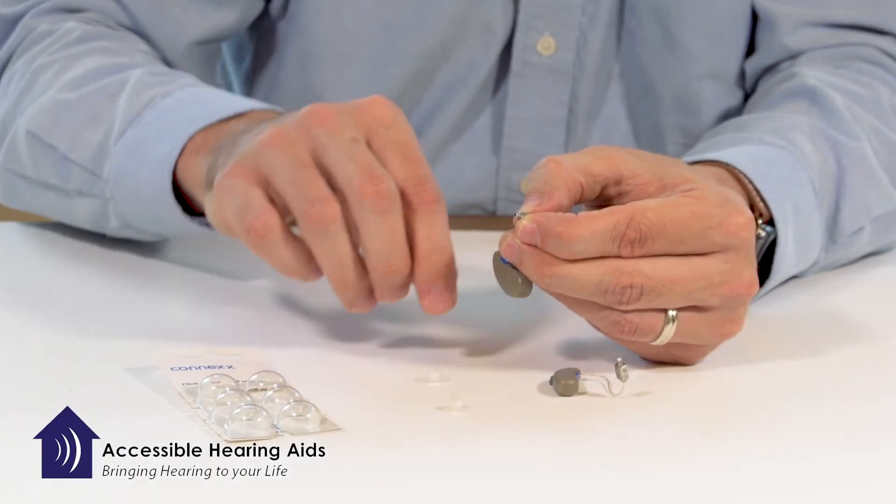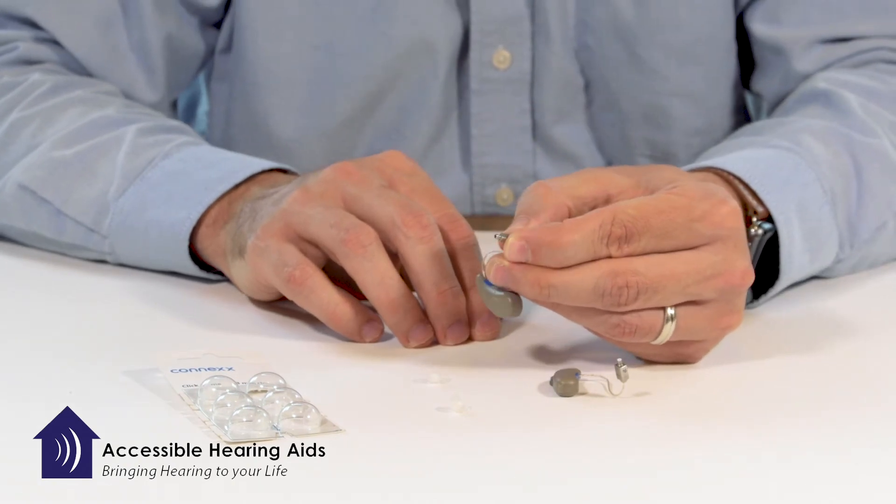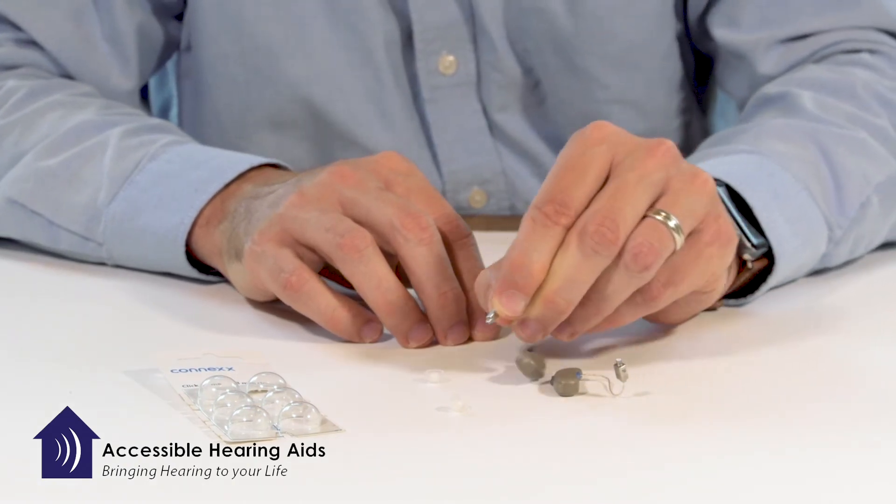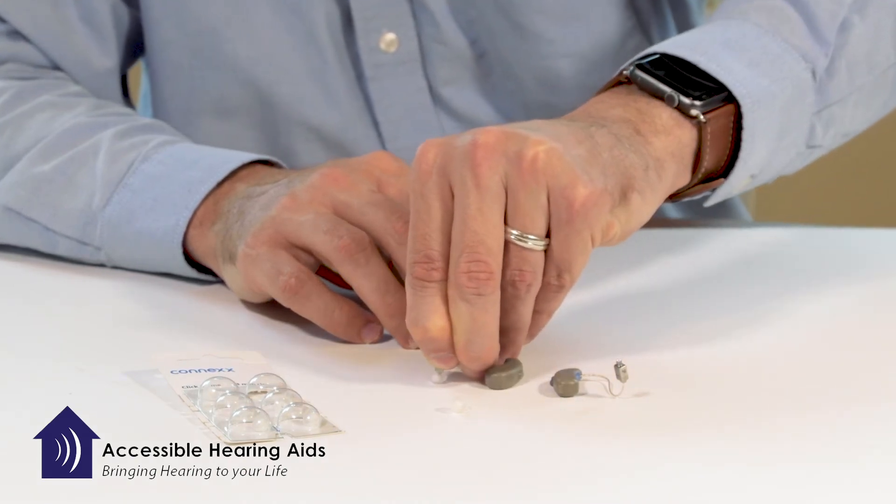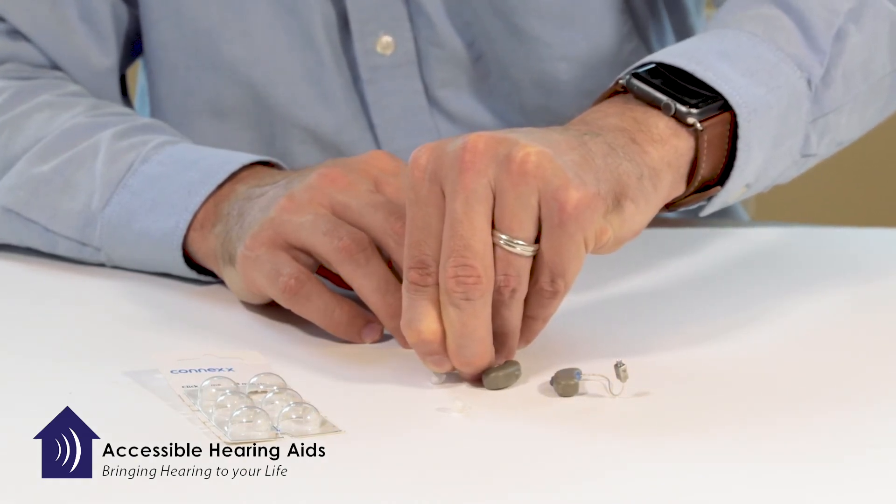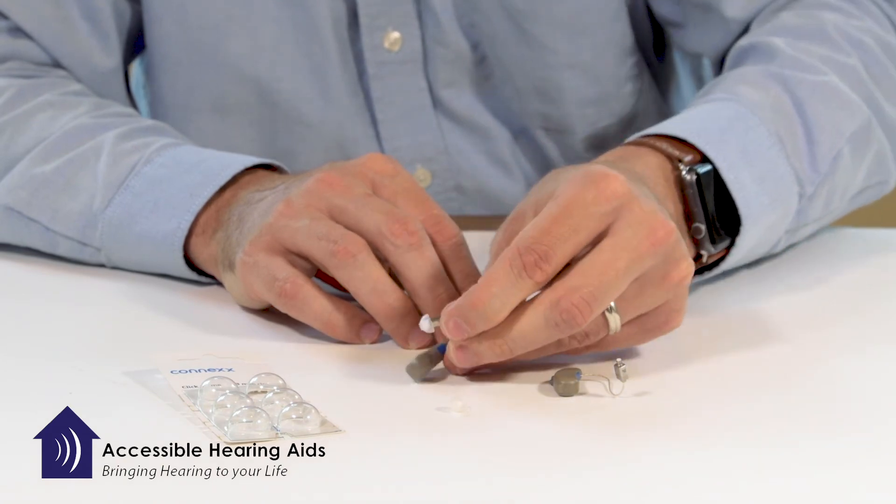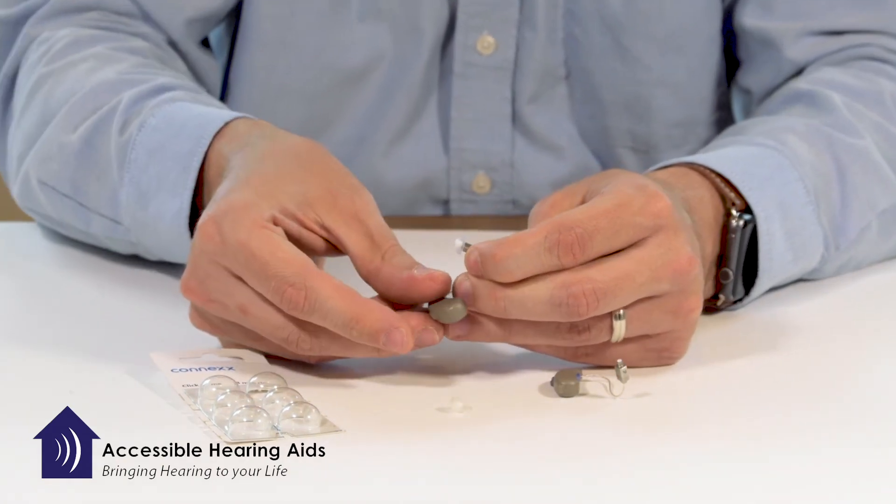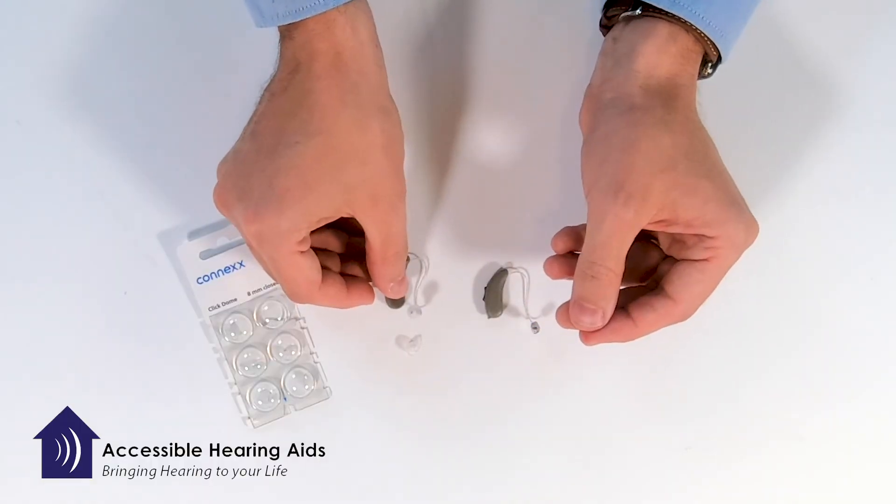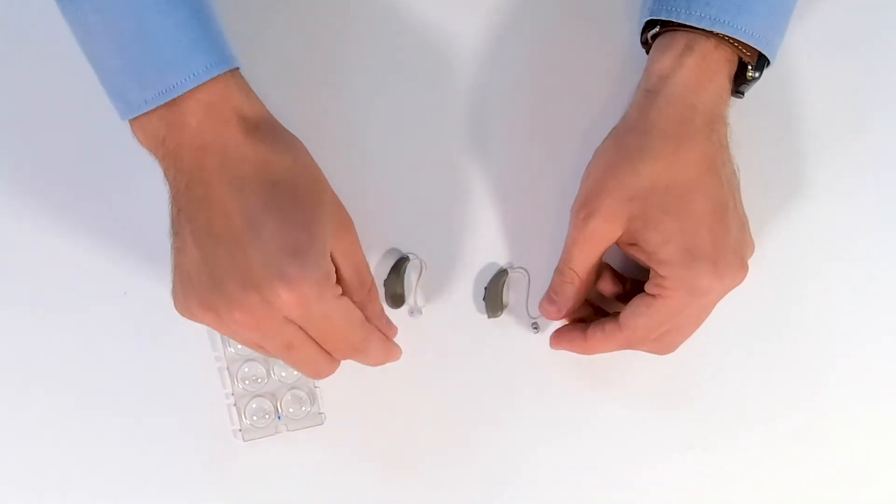You can also lay the tip down on the table and just gently line up the receiver into that hole, and then just push straight down and it will snap. Once it's snapped, you can give it a tug to make sure it's secure.